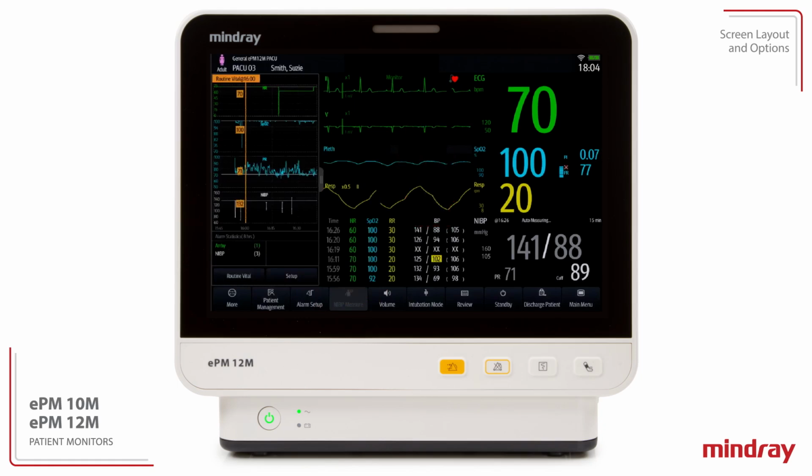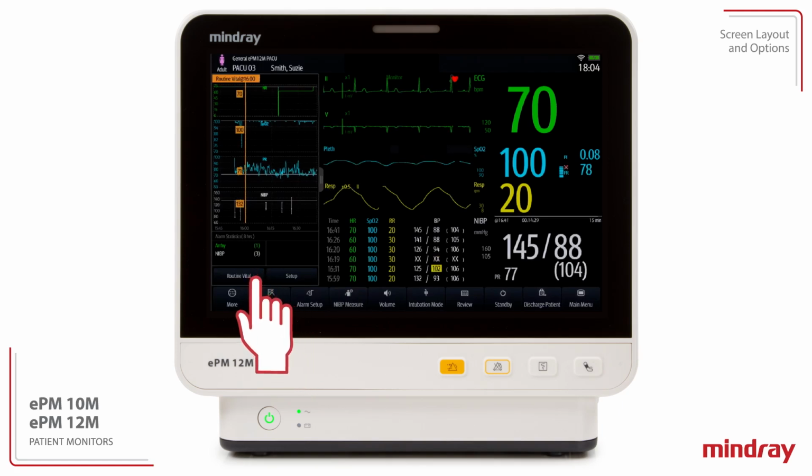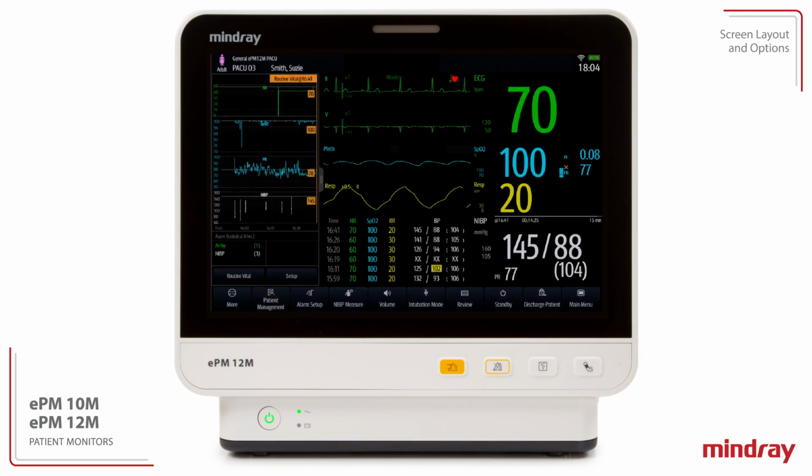During a procedure, the clinician may want to mark the vital signs at the start of a case to use for reference by selecting Routine Vitals. The Routine Vitals measurement time and numeric data are highlighted in orange.